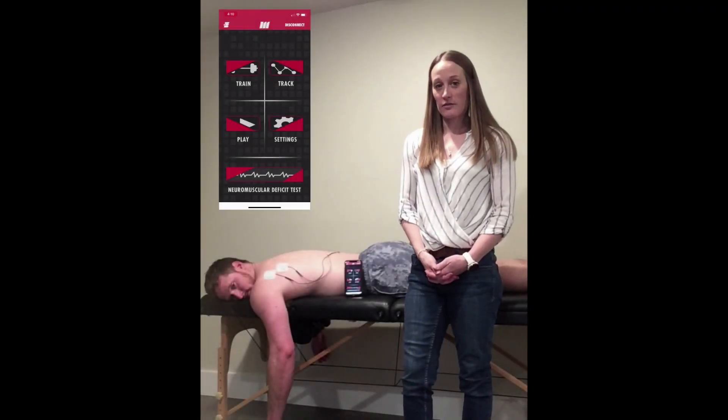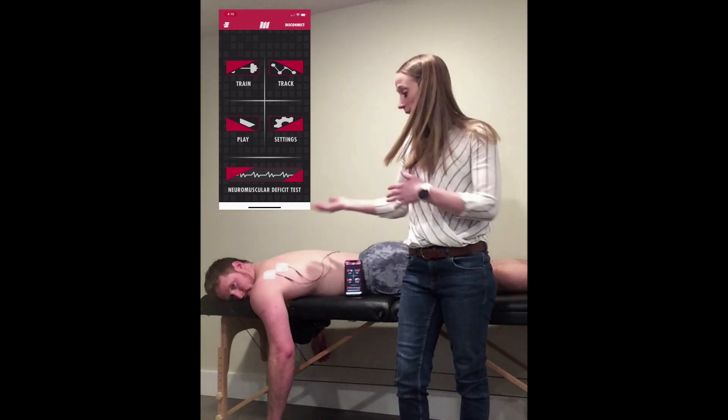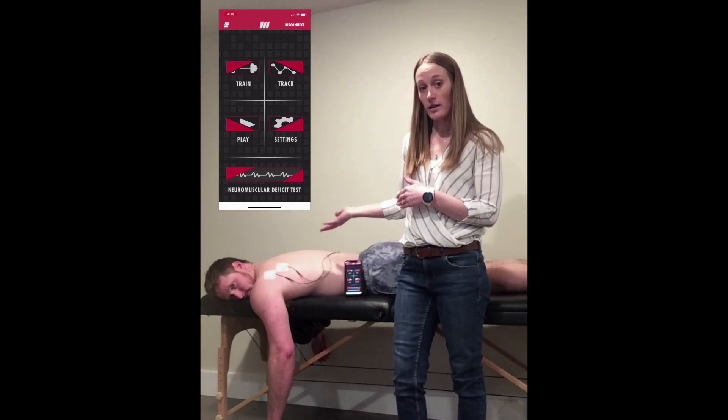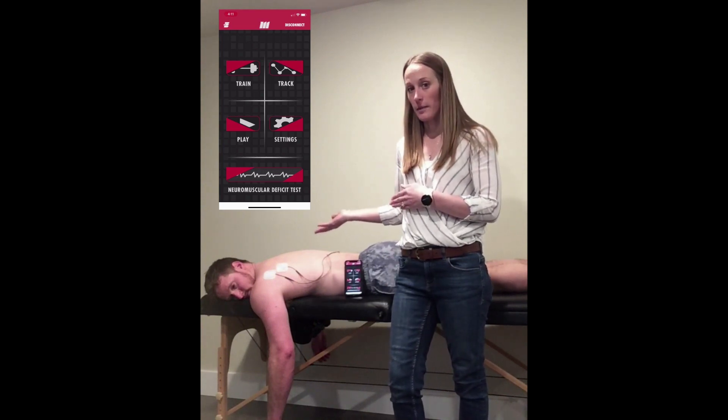Today we're going to go through how to use the audio feedback function in the mTrigger device. To start, audio is attached to channel 1. I have it set up with one muscle on channel 1, and that's what I'm going to receive audio feedback from.